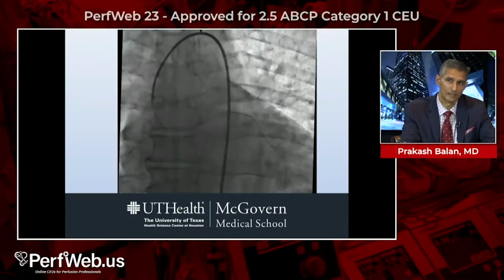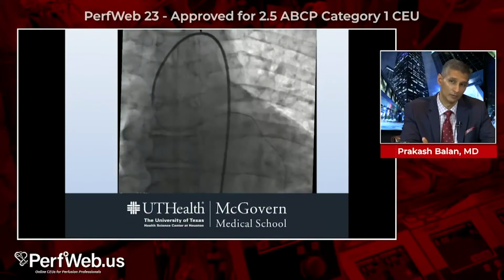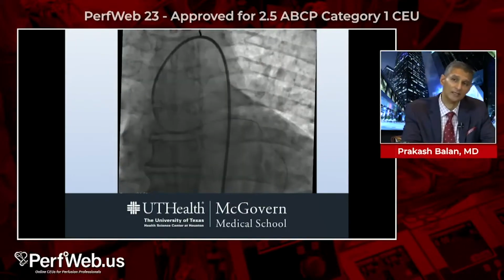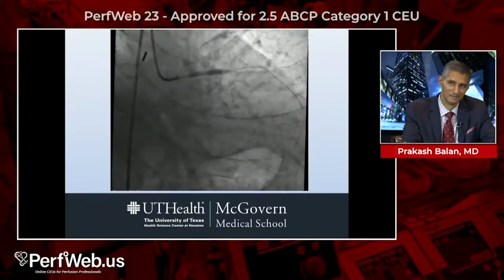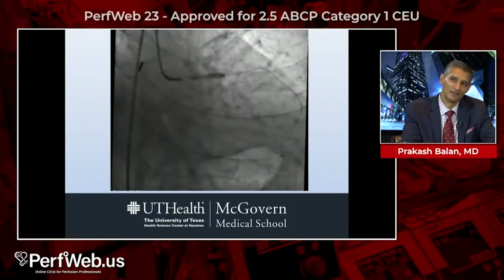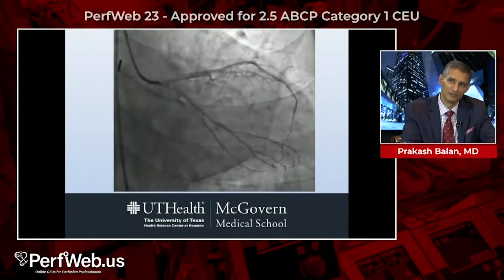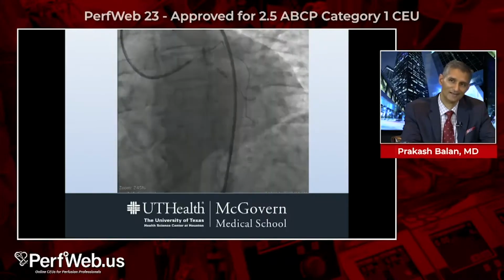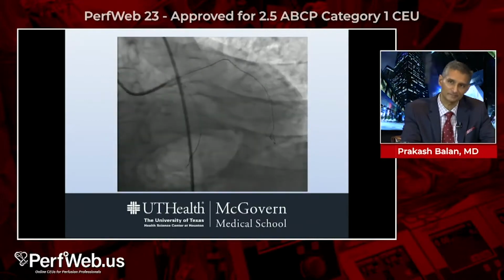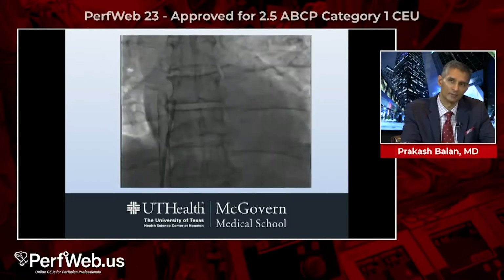Of course, now I started with a balloon pump here. This was very early in my career. This is a case from 2013. And that shakiness that you see in the image is CPR. We bail out the LAD as quickly as we can. But now notice, we've got the LAD back, we've lost the circ. So then you get more CPR as we're trying to bail out the circ here. And we get the circ back quickly, but you can see this is a very unhappy heart.